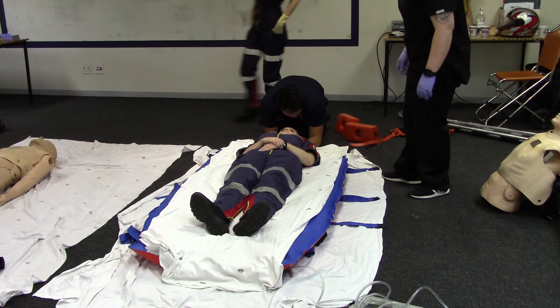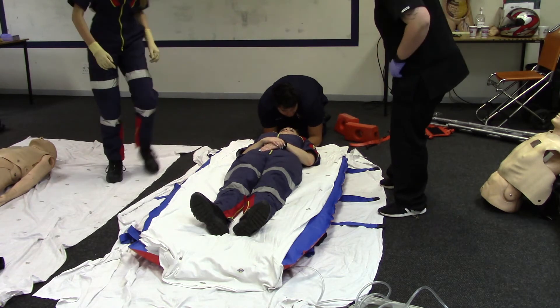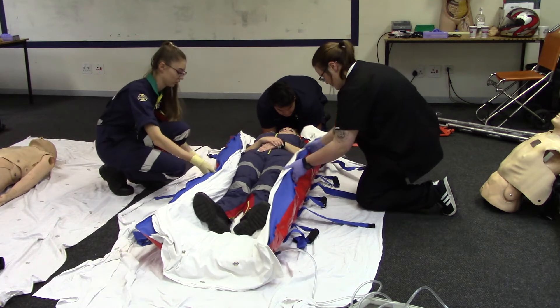Fold the surrounding areas of the mattress towards the patient and clip the straps in a mixed fashion.